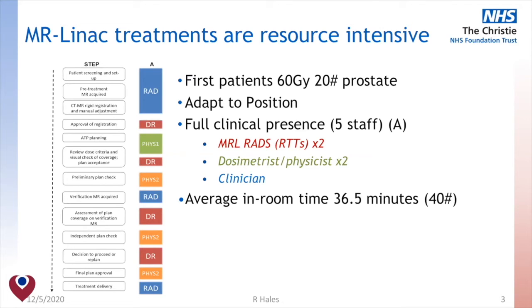The responsibilities of the therapeutic radiographers involved in the delivery of these fractions include safe setup, image acquisition, image registration and treatment delivery. And these core responsibilities are the same as for standard CBCT guided treatment, albeit with a bit of a step change in the technology used.